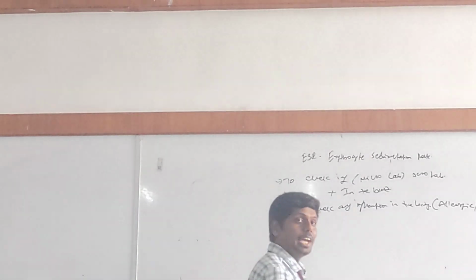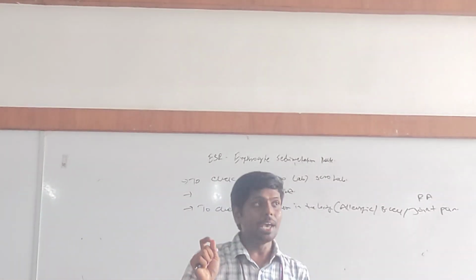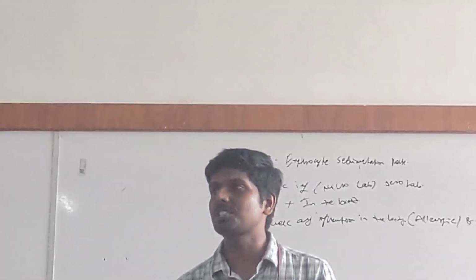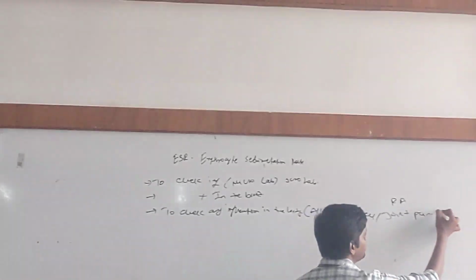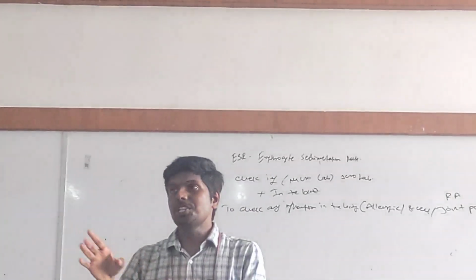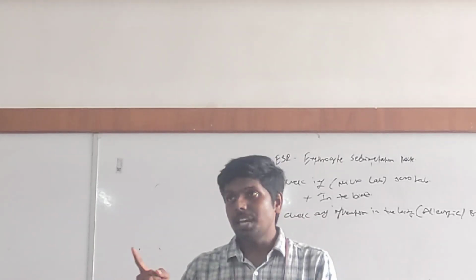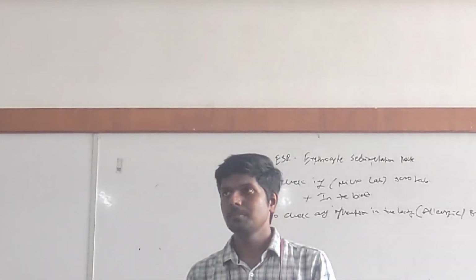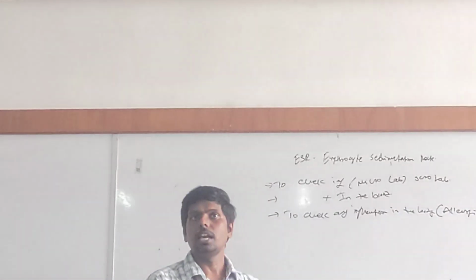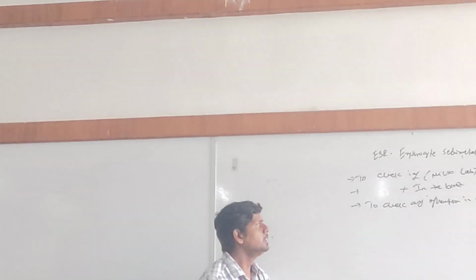And then the primary purpose, or the major significance, of ESR is to check for tuberculosis infection in a patient, to check TB. If ESR is elevated in a patient having cough, chest issues and breathing issues, it might indicate TB. An elevated ESR value indicates TB. Is that clear? So now, let us see how to perform this test.